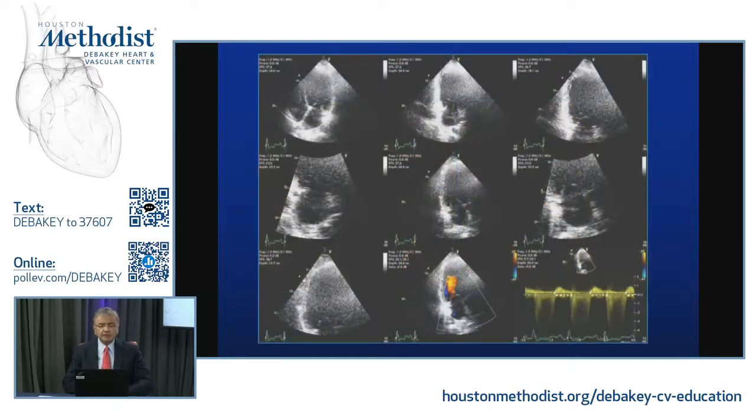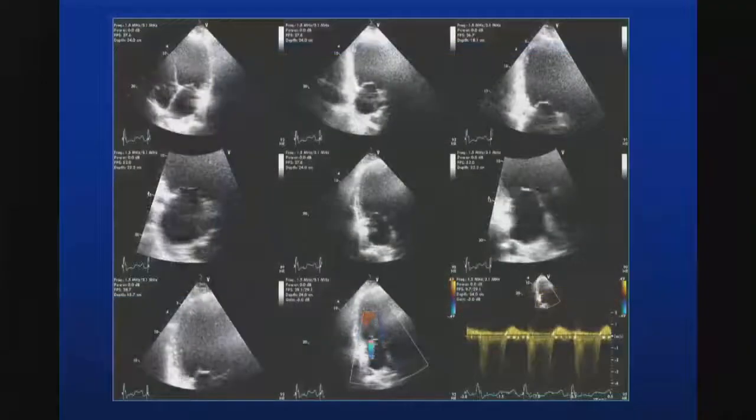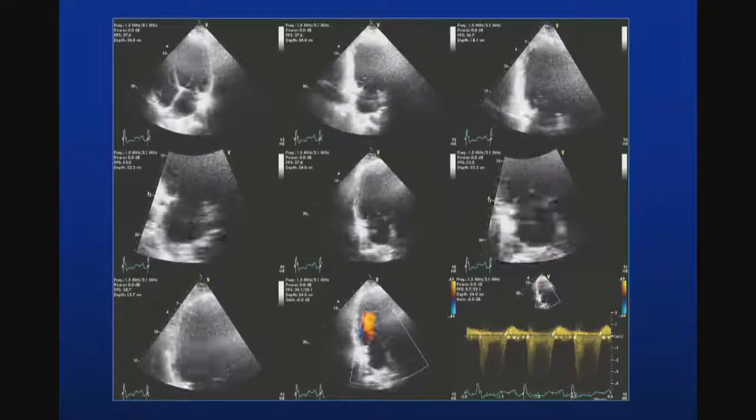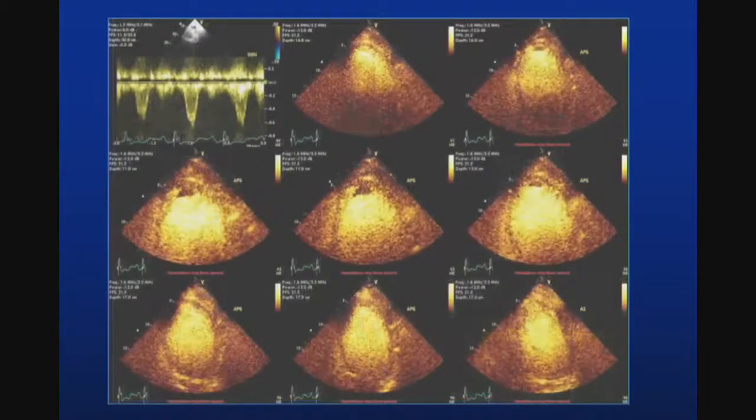I'll show this example for you too. You need to take a look at that. I can't ask you questions directly now if we're in a live audience, but you take a look at this and tell me how much you can see from this and what interpretation you're going to be able to tell. I can tell you what I can venture: that the ventricle is depressed, maybe some regional wall motion abnormalities. I cannot tell the anterior wall. And I'm going to say very depressed ventricular function. The descent of the base is also depressed, right? So let's see what contrast tells us.